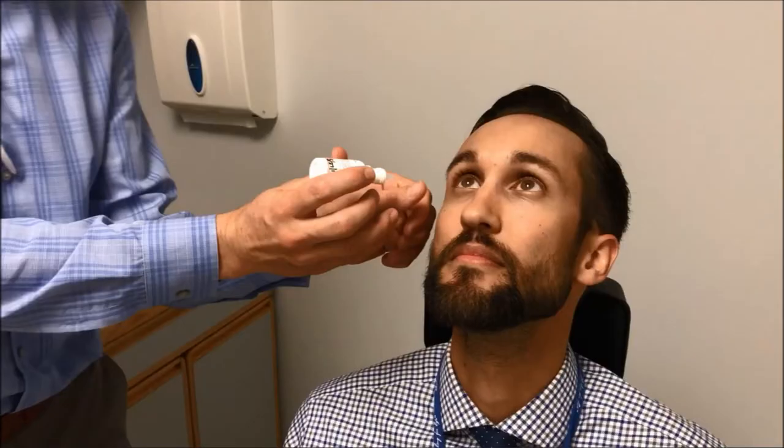A nice way to administer the numbing medicine is to ask the patient to look upwards and then drop the medicine into the lower eyelid. Look all the way up. Keep looking up.